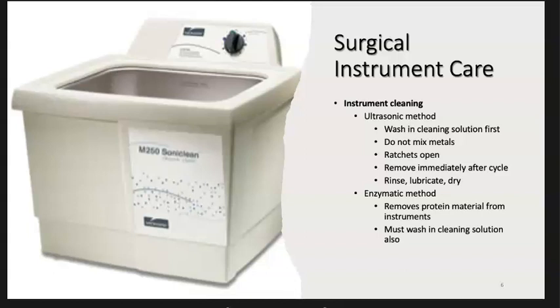Once a surgical procedure is complete, you can collect the instruments from the surgery suite and wash them in a sink full of bactericidal or bacteriostatic dilution with water. This will help remove any of the tissue debris or blood proteins left on the instruments.